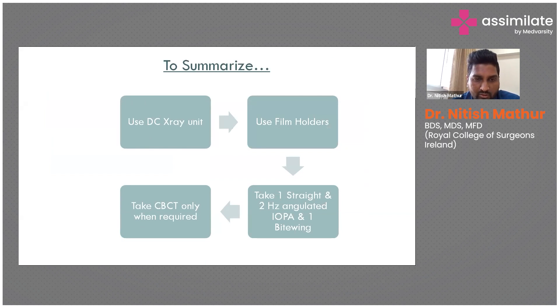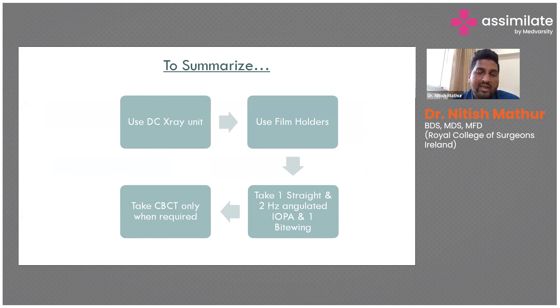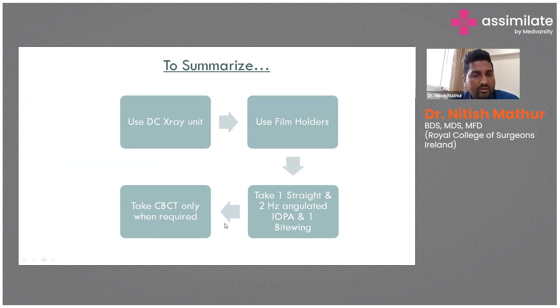To summarize, to produce a better quality image: use a DC unit, use film holders, take one straight, two horizontally angulated, and one bitewing radiograph to assess restorability. CBCT should be taken only when required; otherwise you will overestimate and over-analyze.